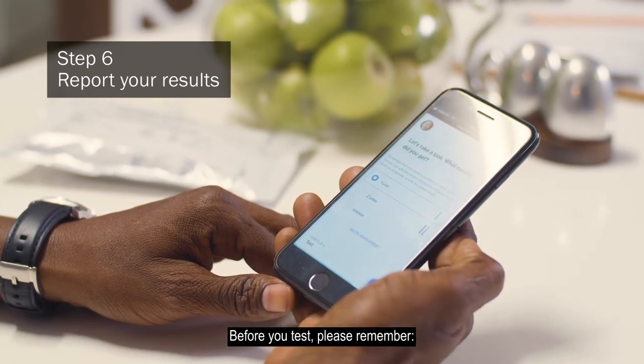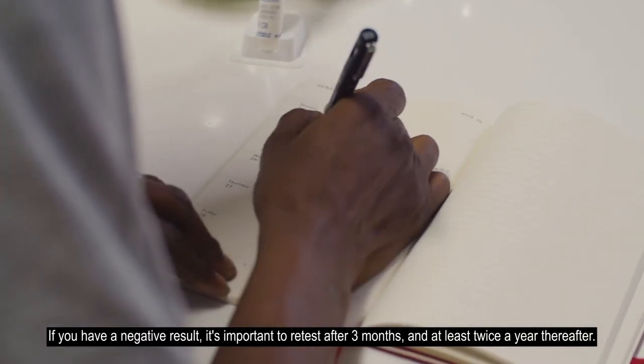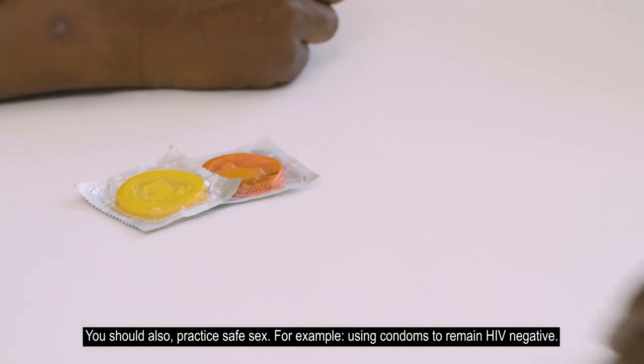Before you test, please remember: if you have a negative result, it's important to re-test after three months and at least twice a year thereafter. You should also practice safe sex, for example using condoms, to remain HIV negative.